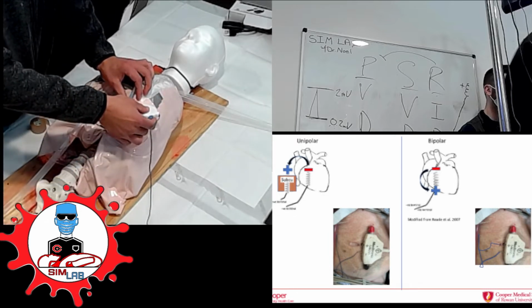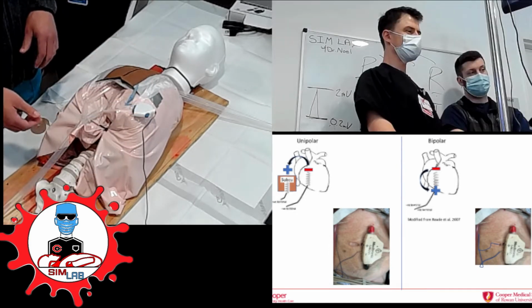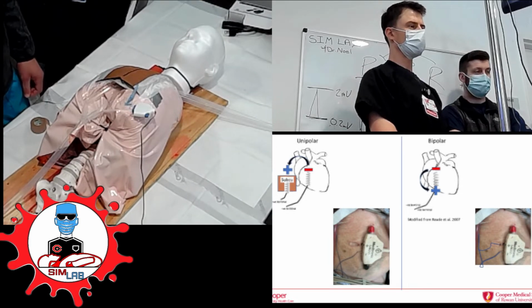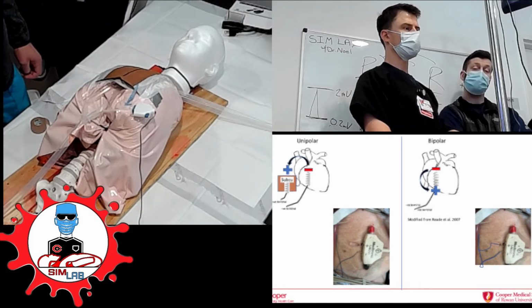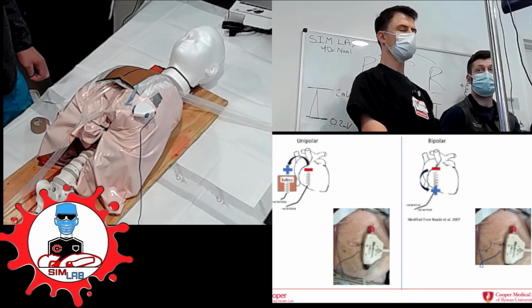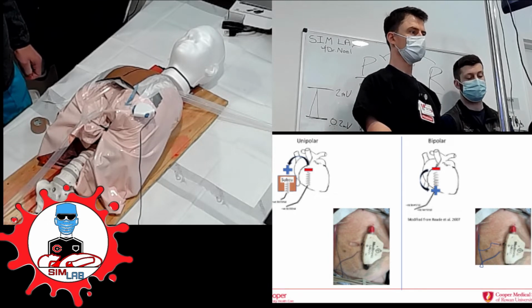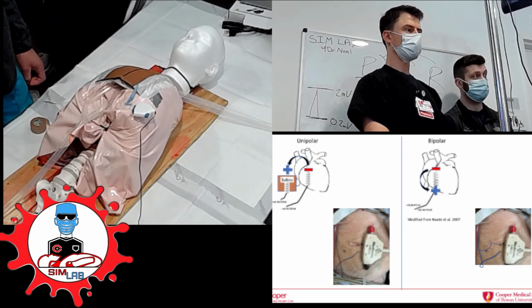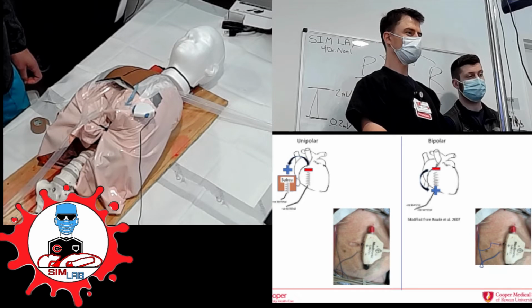Now, some of the nurses may hand you a set of alligator clips because that's the way they're used to seeing it. I think this is Dr. Noel's ingenious way of hooking up directly into the connector, or you can put another needle in there and connect two alligator clips to each to complete the circuit. Make sure you get a big enough bite of the skin, because it matters. These patients tend to be post-op day 2 when their pacers fail, so they're going to be awake. Don't be a chicken, because it's life, death, or a needle pinch. So get a good bite.